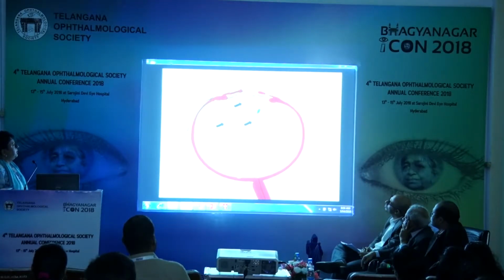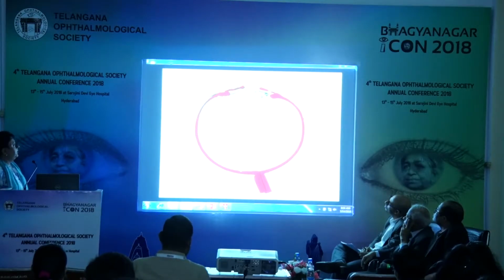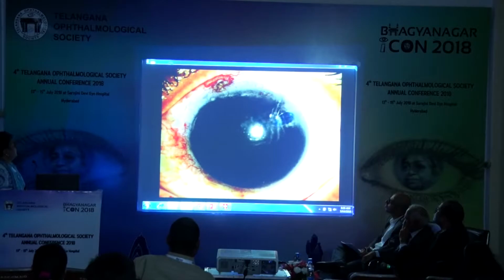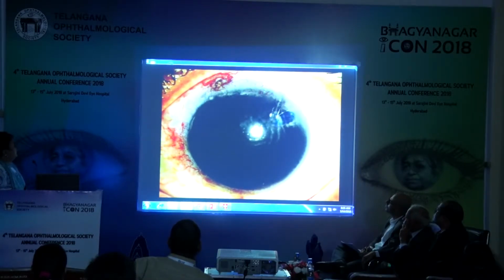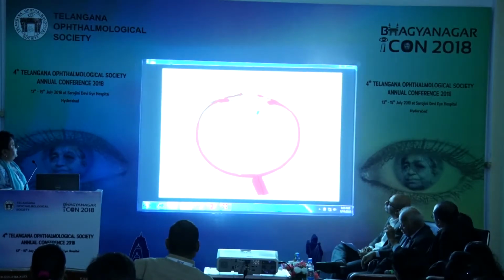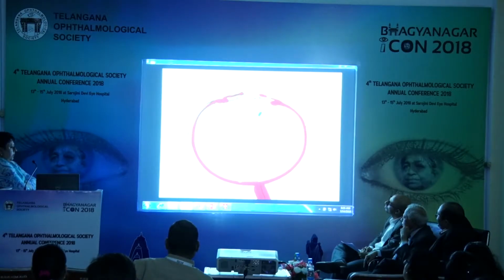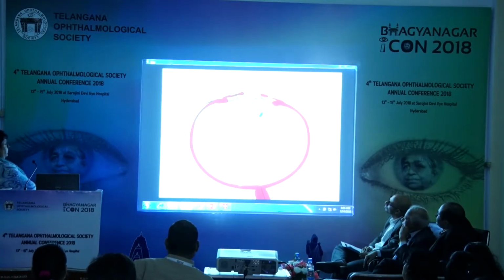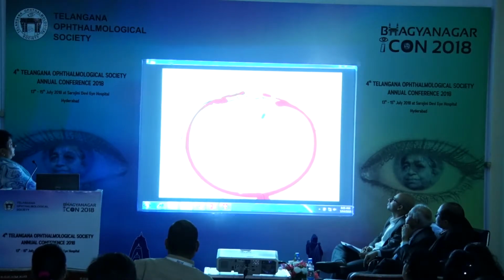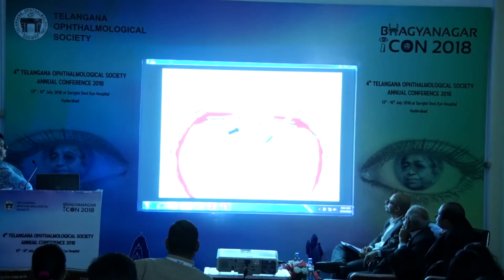She was then scheduled for a zonulo-hyaloidovitrectomy through her pre-existing PI soon thereafter, as corneal decompensation was a distinct likelihood. We present this relatively simple technique performed with an anterior vitrector using anterior vitrectomy settings by an anterior segment surgeon for prompt reversal of aqueous misdirection and a sustained long-term resolution.